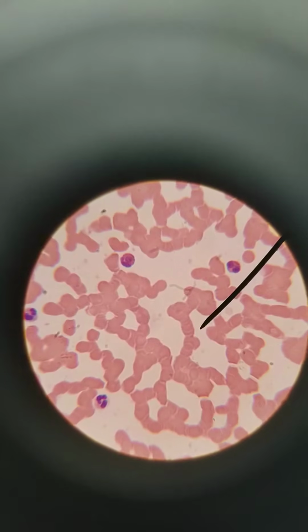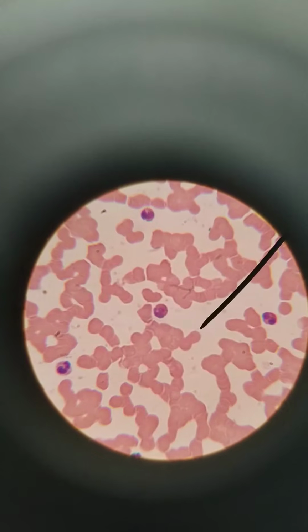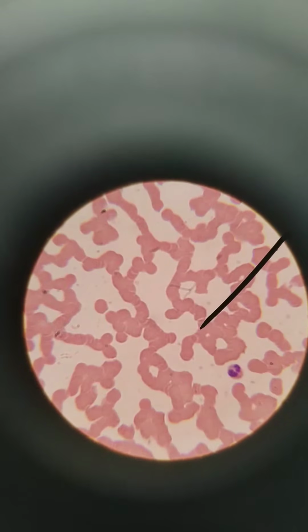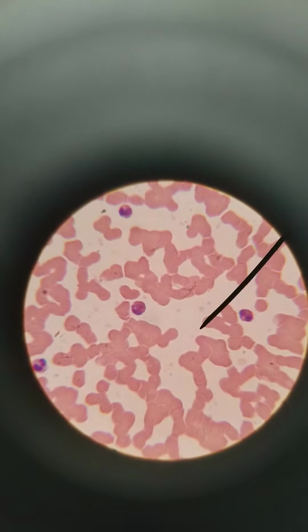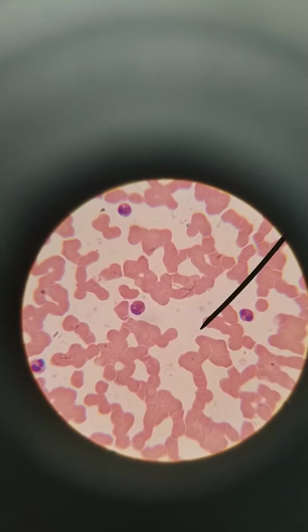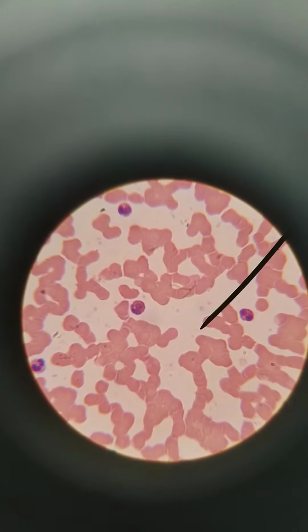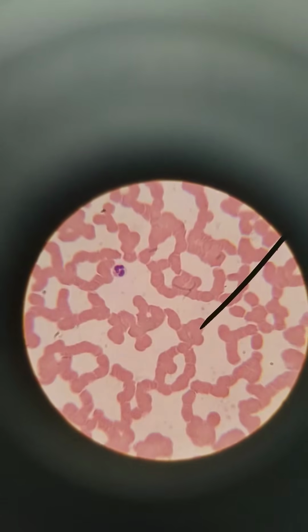But looking at the white blood cells, the leukocytes, we're seeing more eosinophils than normal. The one on the top there, in the middle, and the right, those are eosinophils. You can see the dark pink granules. So this condition is eosinophilia. When would you have a really high amount of eosinophils, more than normal? You would have this, say, if you were infected with a parasite. So that could be an example of eosinophilia.